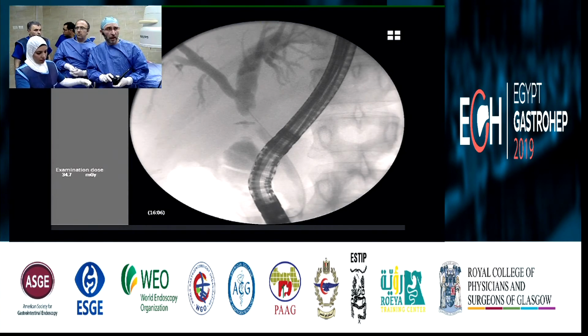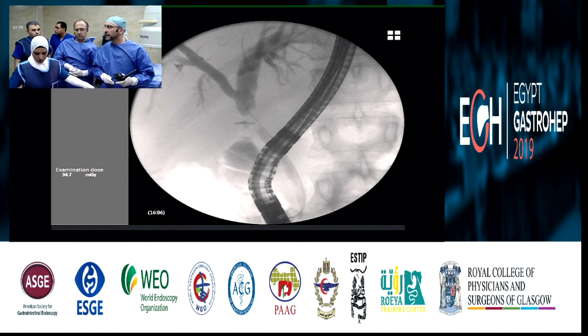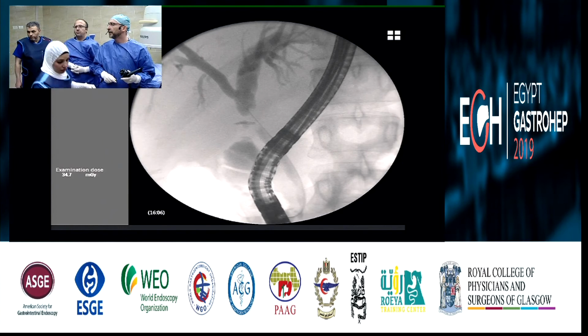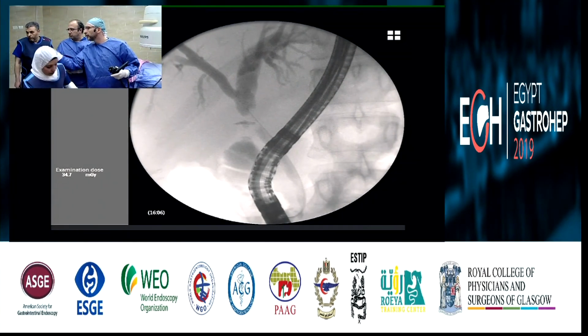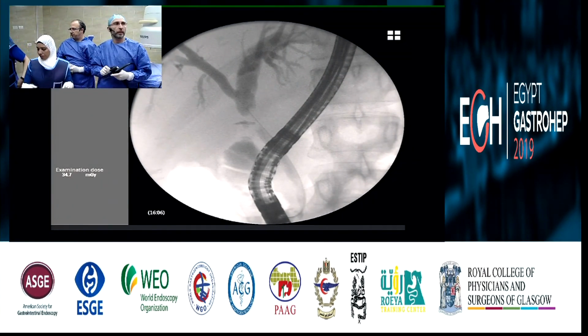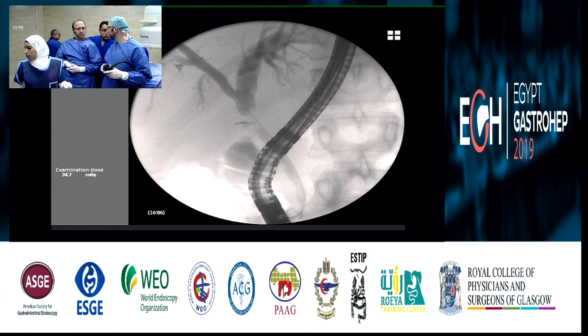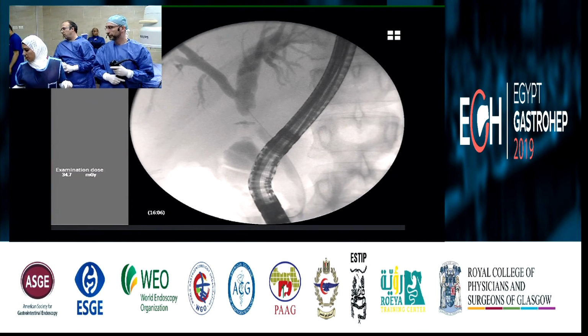I will dilate now with 6 millimeter. Yes, we'll dilate it. Balloon, please. What size of balloon dilation will you use? 6 millimeter. Sorry? Biliary balloon dilator. Okay. Hurricane is okay.